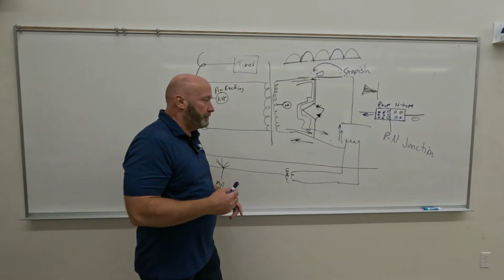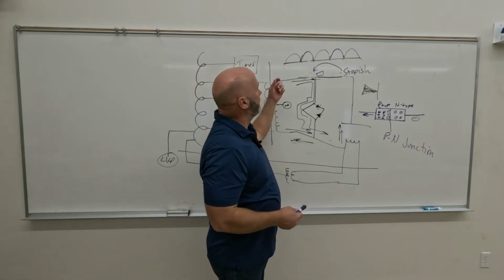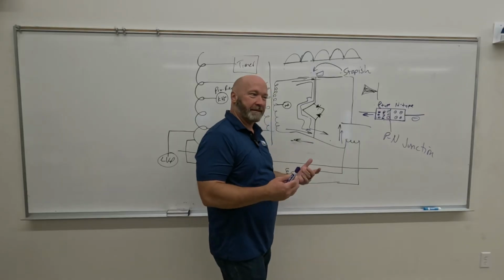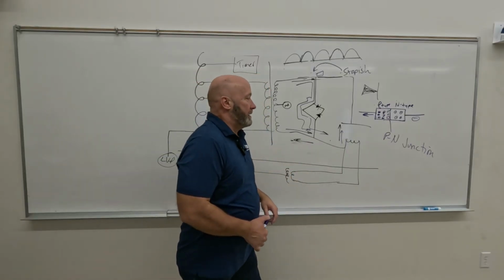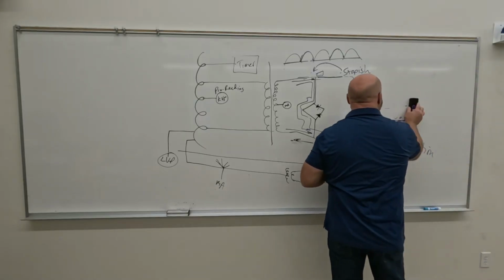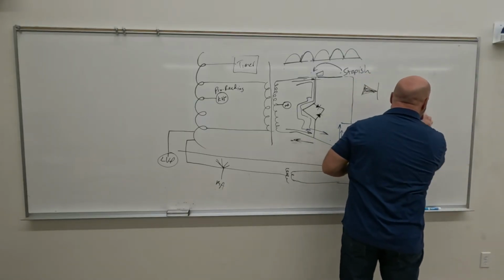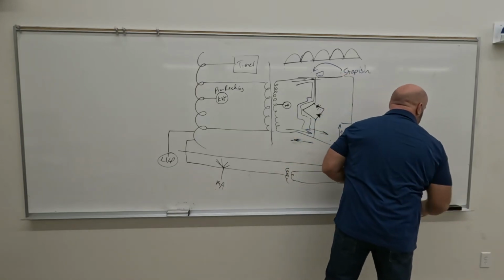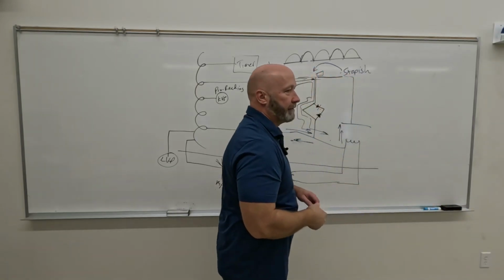So then that'll probably come off the registry at some point. It's still on for now. So what we do have though is that room is three phase and what we refer to as high frequency.